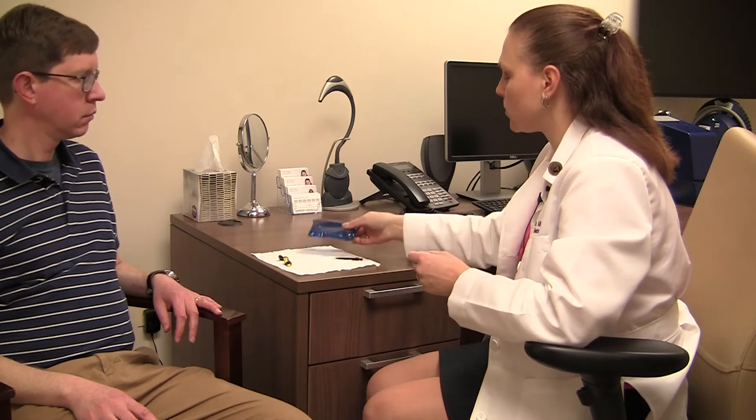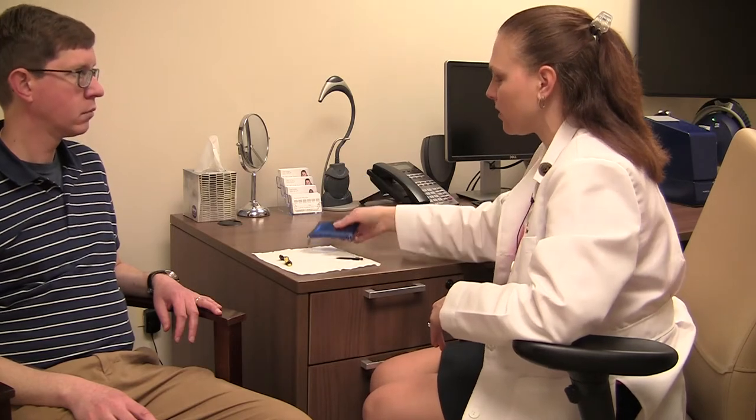I'm going to make you a goodie bag before you go home. There's a little carrying case for you to put them in. This prevents you from having to stuff them in your pocket, put them in a Kleenex, or throw them away by accident. They're not super expensive, but we don't need to be buying them every couple of weeks. A lot of people go to the drugstore and get a little contact case if they want extra ones — one in your bag, one in your carry-on luggage — just something safe to put them in.